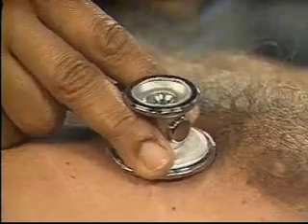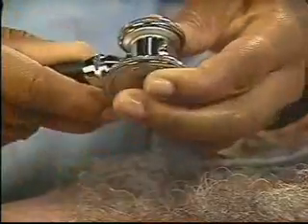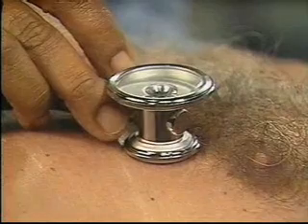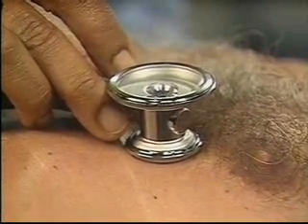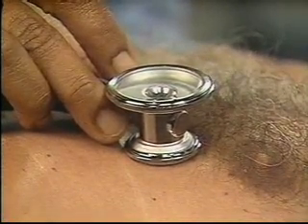Now switch to the bell of the stethoscope, which is more sensitive to low-pitched sounds such as S3, S4, and the murmur of mitral stenosis. Listen at the apex again.